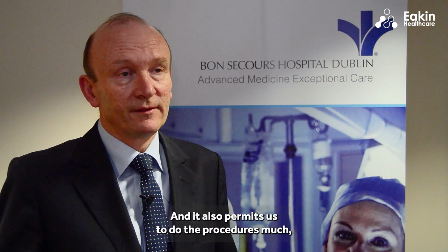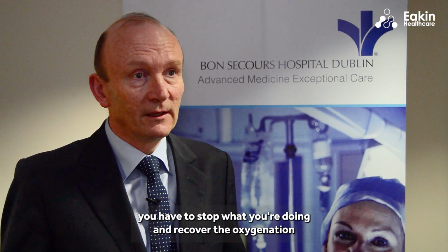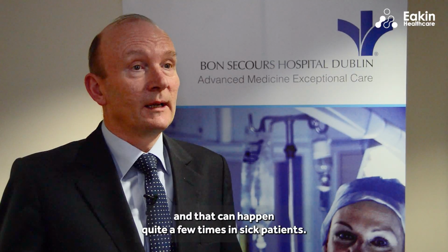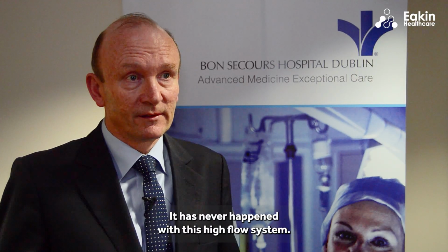And it also permits us to do the procedures much more quickly, because if the oxygen level drops, you have to stop what you're doing and recover the oxygenation. And that can happen quite a few times in sick patients. It has never happened with this high flow system.